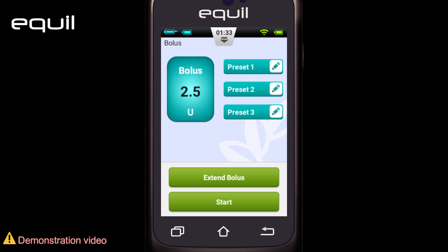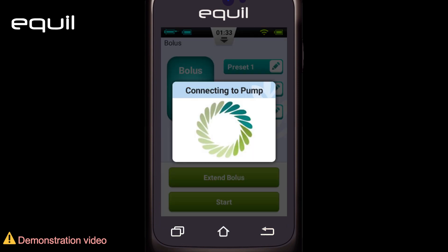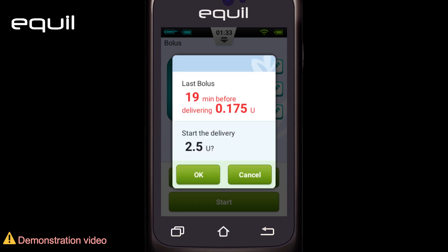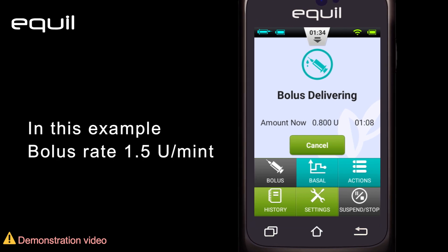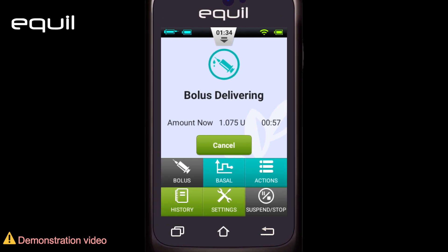The amount of insulin units will appear inside the box and the start button will turn green, meaning it's ready. Click the start button to begin administering the bolus. A 'Connecting to pump' animation will appear and a window will open for you to confirm that you want to send the bolus command to the pump. Your last bolus amount and time will be shown as a reminder. Click OK. The PDA will revert to the home screen and display the bolus delivery status at the rate previously configured. The bolus button will be inactive until the bolus is delivered in full.